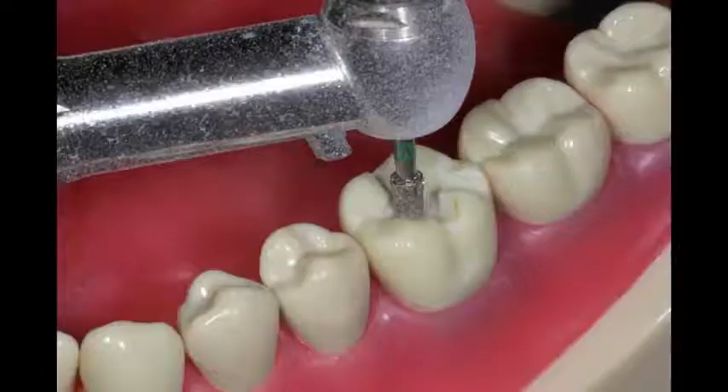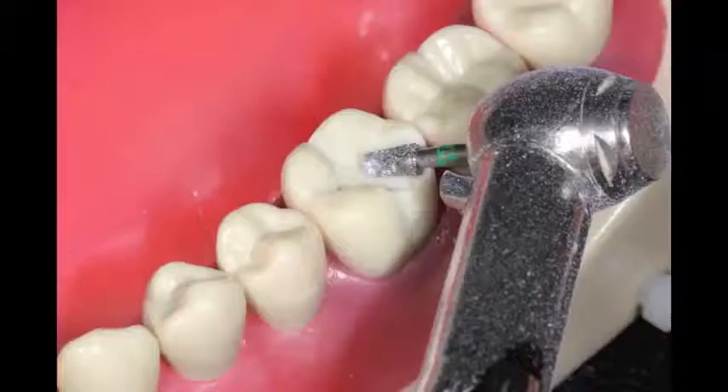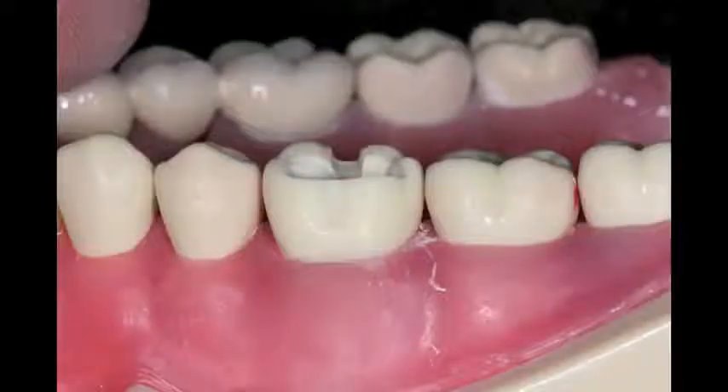I will reduce the occlusal grooves using that fat diamond burr, then go on to remove the buccal and lingual cusps.